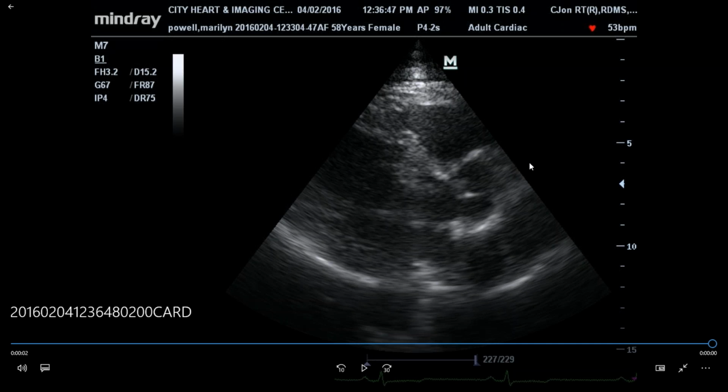So you have to imprint this in your brain. All right. So again, the chest wall is up there. Then you get to the RV wall. This is the RV outflow tract, RV cavity. This is the septum. The LV cavity is right inside there. Below the posterior wall, you have your pericardium, and this is the descending aorta. The mitral valve is right here, the anterior leaflet of the mitral valve, posterior leaflet, the left atrium.